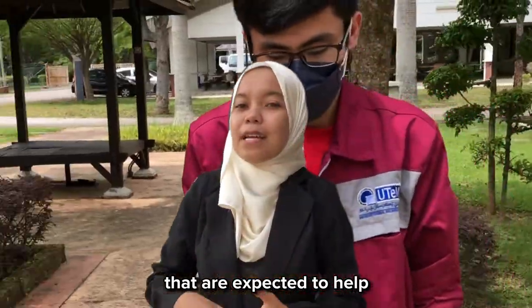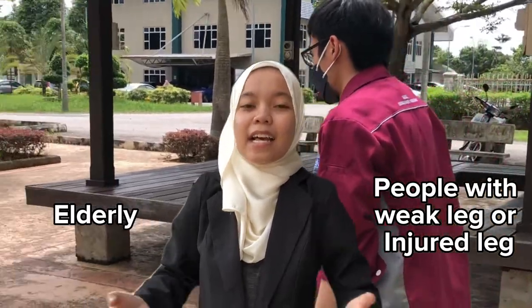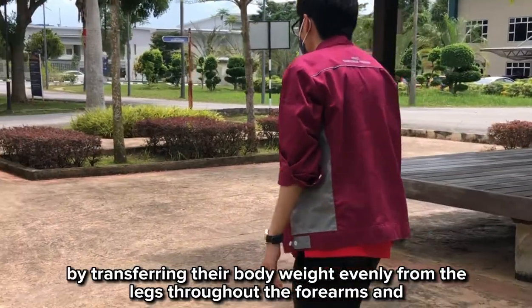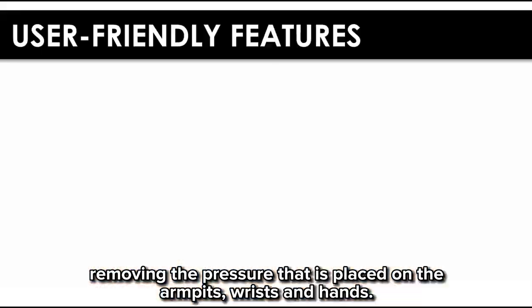This product is expected to help the disabled, people with arthritis, seniors, and people with weak or injured legs, by transferring their body weight evenly from the legs throughout the forearms, and removing the pressure placed on the armpit, wrist, and hand.